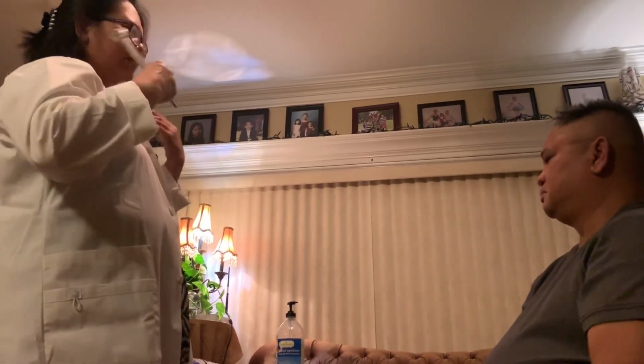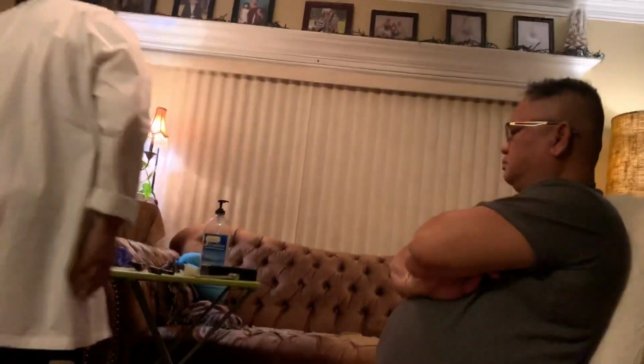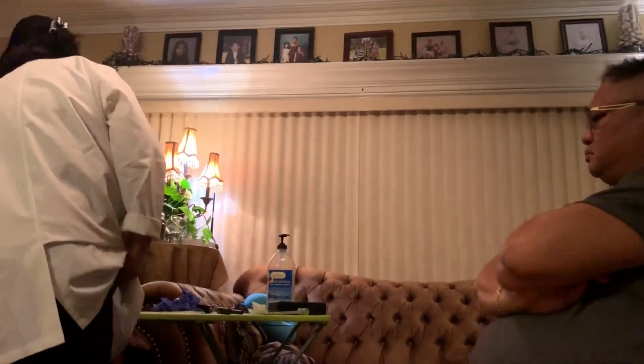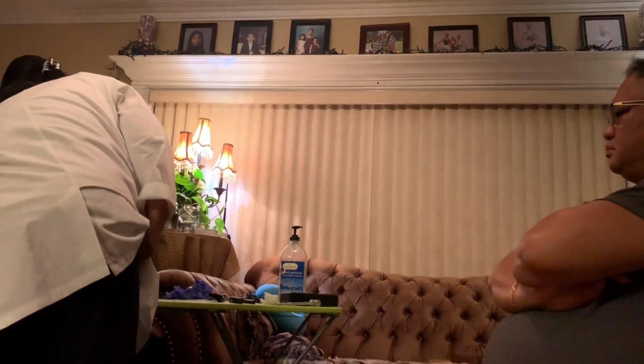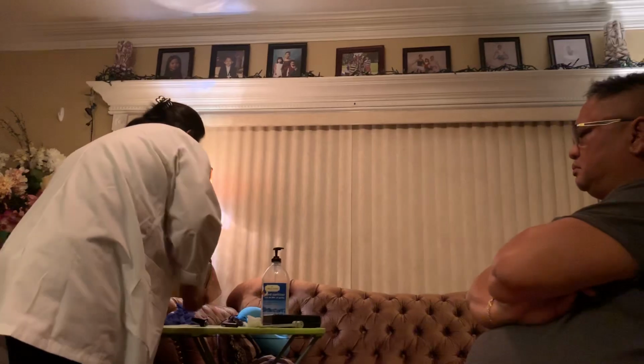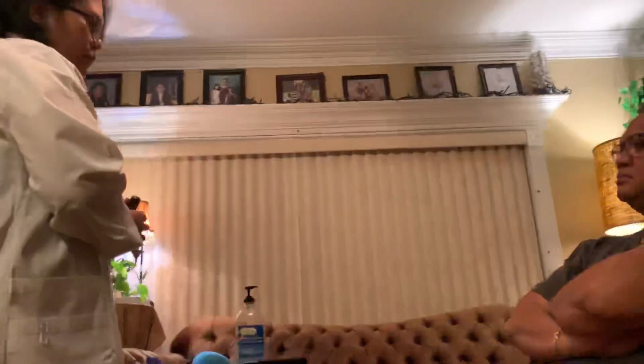I mean, you can hear bilaterally with the air conduction, more sensitive than the bone conduction. The next testing that we are going to do is I'm going to use the otoscope, and I'm going to check your external canal, your tympanic membrane, and the cone of light.